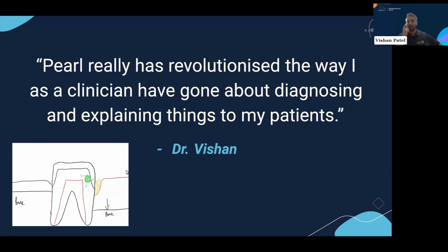Yeah. I mean, the fact that you can edit everything in Pearl is a good thing, because if you don't agree with it, it is AI and it's obviously constantly learning. So you need to make sure that you're not just taking its word for everything. You're also using your own knowledge and then putting two and two together, really.